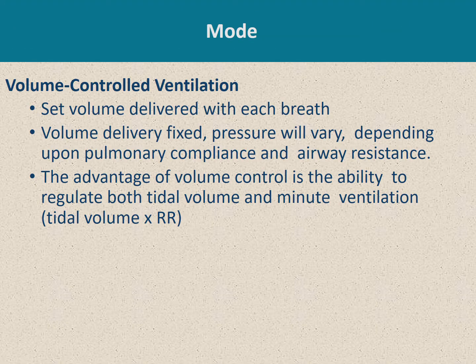First, we will start to speak about the modes of mechanical ventilation. We will start with volume controlled ventilation or volume target ventilation. There are different modes that apply volume controlled ventilation.